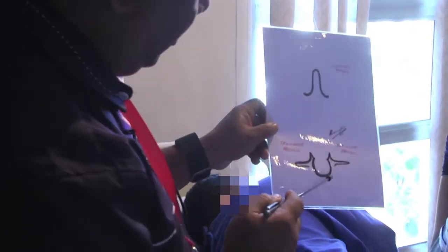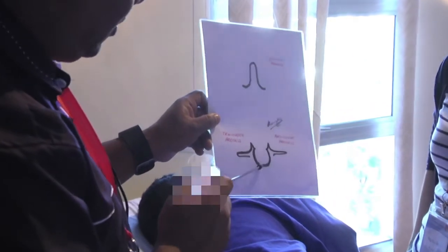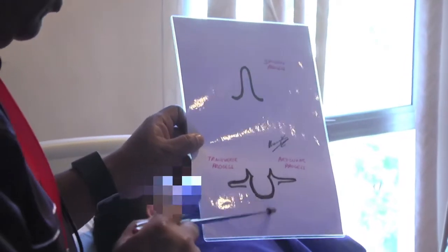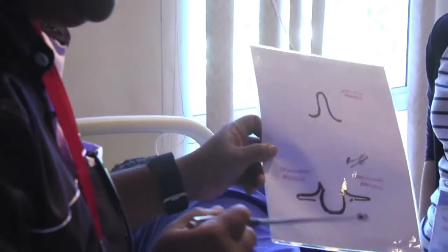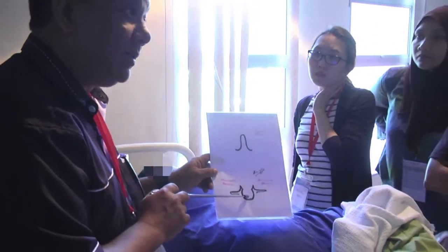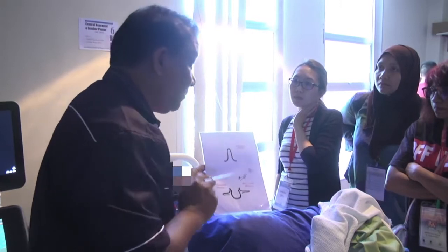Also, I'd like to point out that this is the anterior complex, we call this. Normally you see the posterior surface of the vertebral body. There's also the posterior ligament and the anterior dura. When we were doing our initial research in this area, we said, how do we nomenclature this? Because there was no nomenclature. So I said, we should call this the anterior complex because we have no business over there. If you try to put your needle in the anterior epidural space, ma'am, you have a problem.